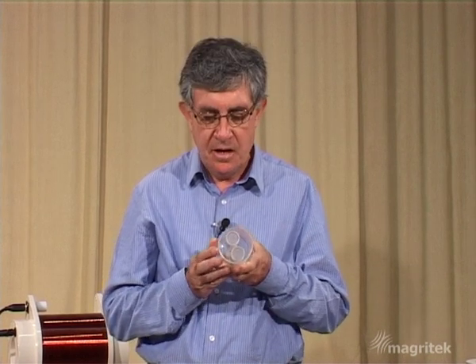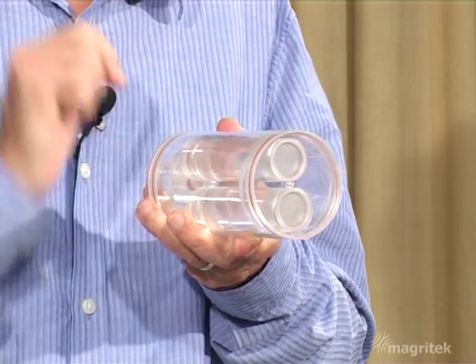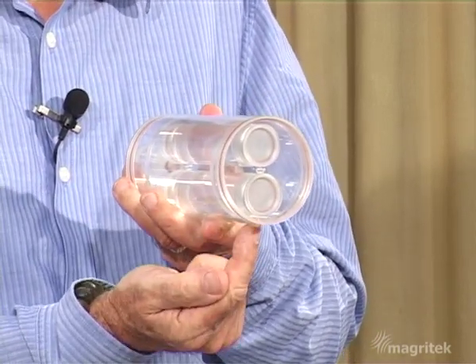Remember that the Larmor precession frequency of the nuclear spins depends upon the strength of the magnetic field. Now just imagine if we could make the magnetic field higher on the top tube and lower on the bottom tube. That would mean that the top tube would have a higher frequency and the bottom tube would have a lower frequency, and if we looked at the spectrum of that we should see two signals at two different frequencies corresponding to the two tubes of water.